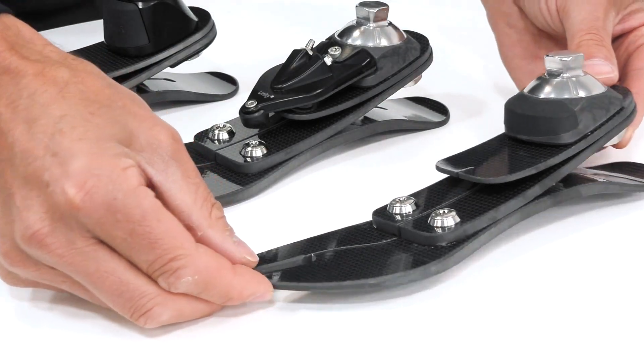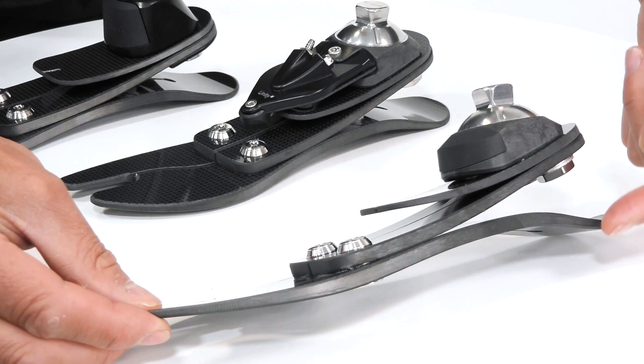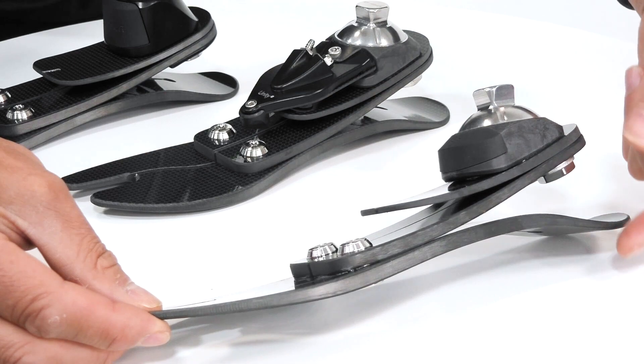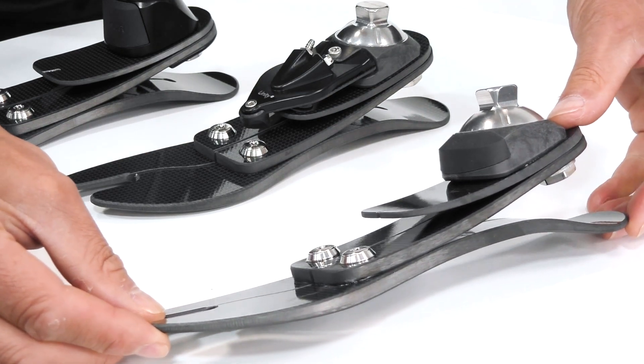The Proflex LP has a build height of around seven centimetres, which gives a lot of people with longer residual limbs an opportunity to enjoy this high-performance low-profile foot.